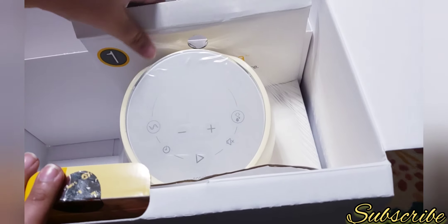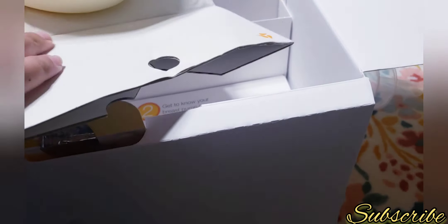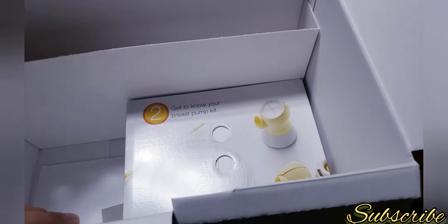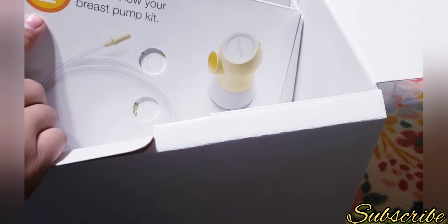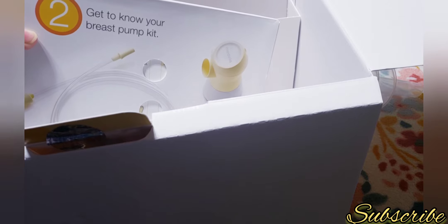The last thing I see is the big breast pump machine itself, wrapped in paper. On the bottom there's more stuff — oh, I didn't know there was so much! There's a number two box that says 'Get to Know Your Breast Pump Kit.'